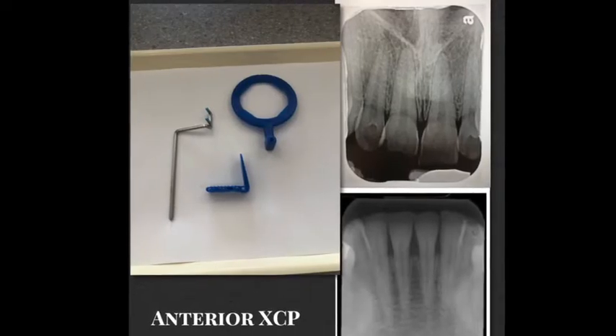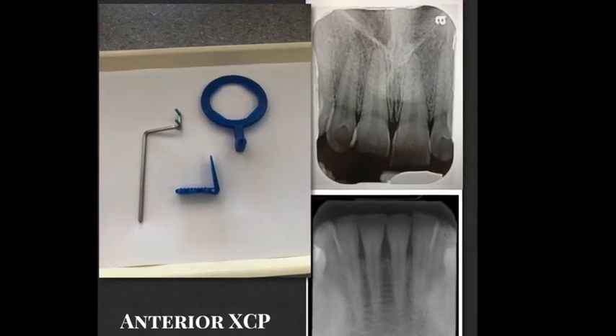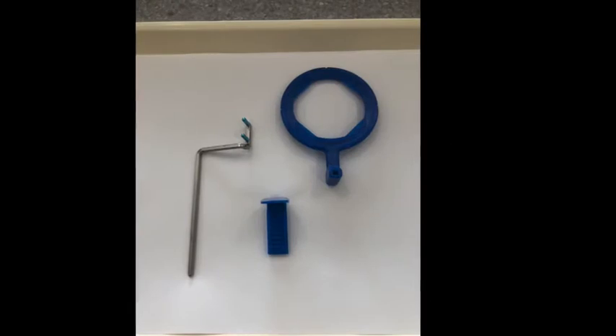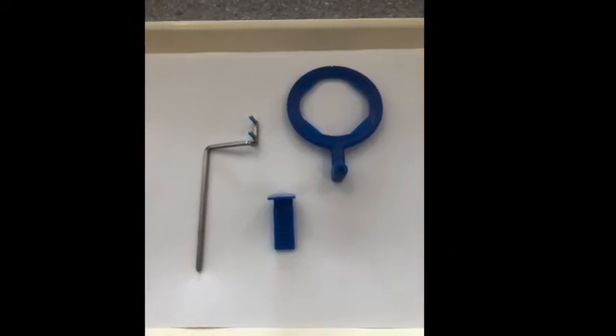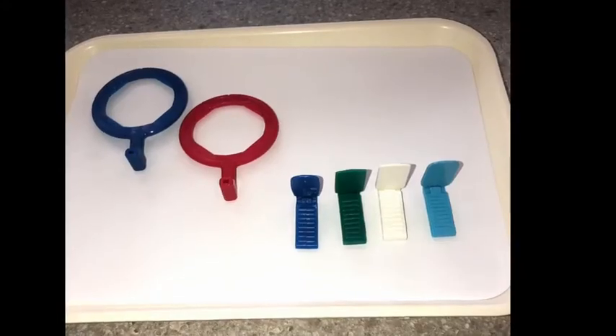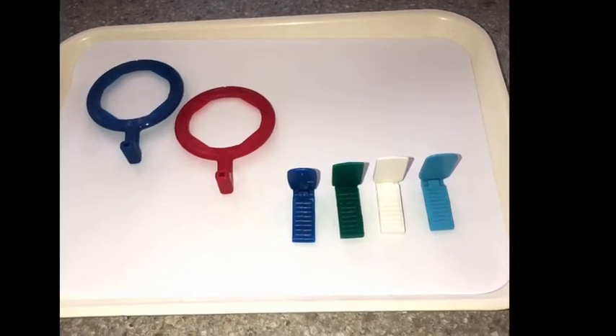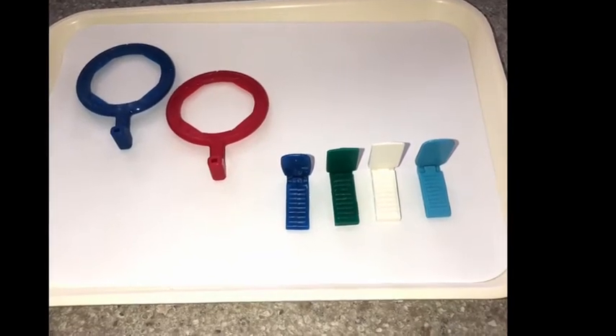Here is for an anterior PA, or periapical, to see the roots of the anterior teeth. Here is the bar you'll need, the ring, and the bite block. This also comes in different colors, so don't get set on the color that you have. Focus more on the shape.